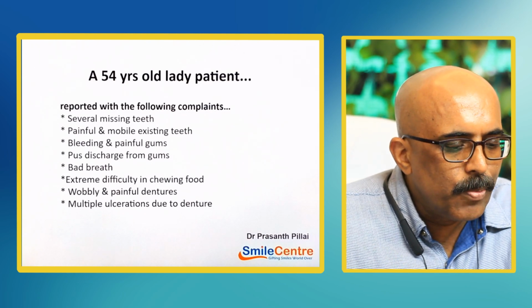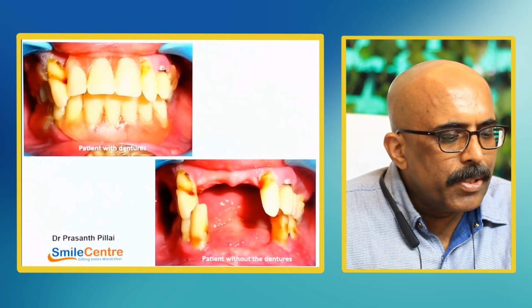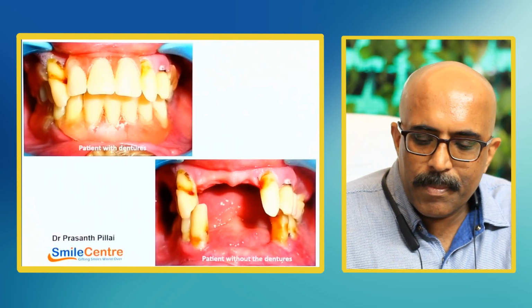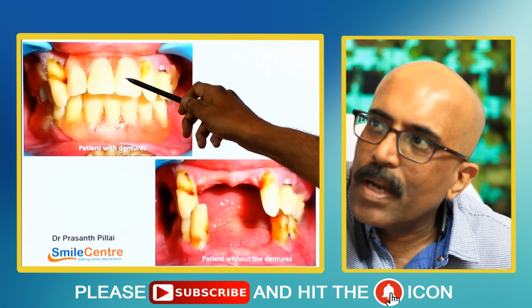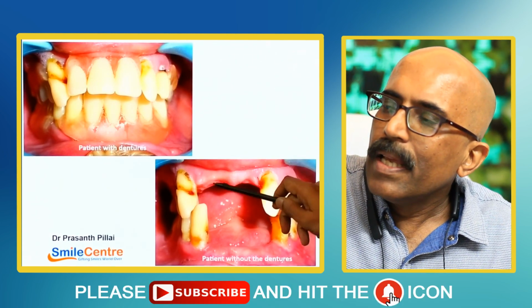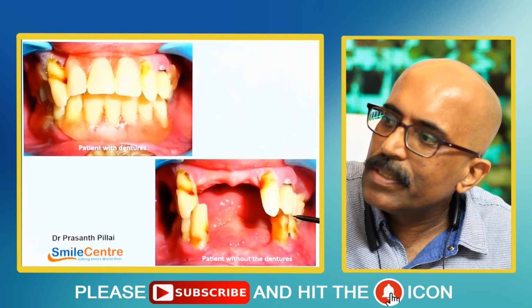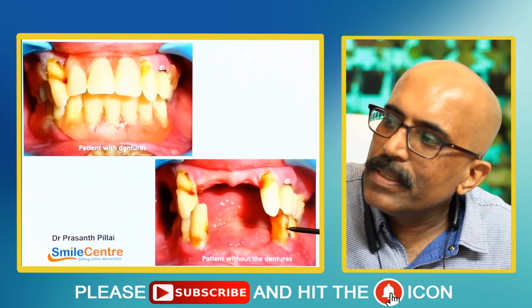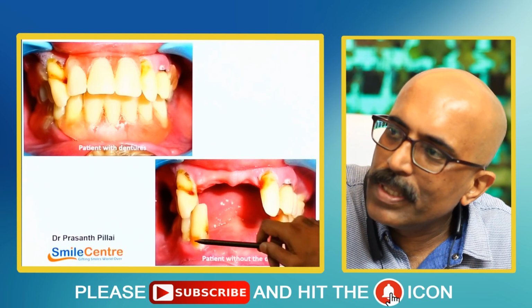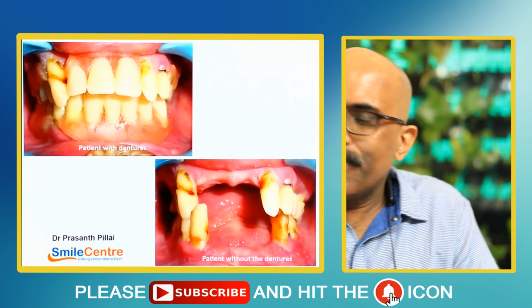She could not chew food properly, she could not smile properly, she had multiple issues, and that was the situation in which she came. You can see she was wearing a denture. These were the upper and lower dentures she was wearing, and this is the gums. You can see the gum after the denture has been removed, and as you can see, the dentures were taking support from the natural teeth which were there, but even the natural teeth were giving way because of gum disease.